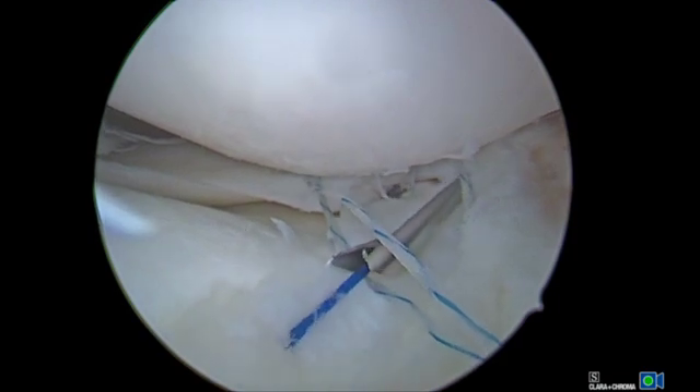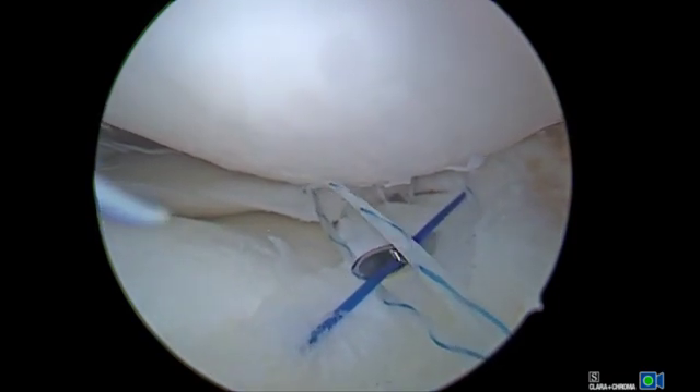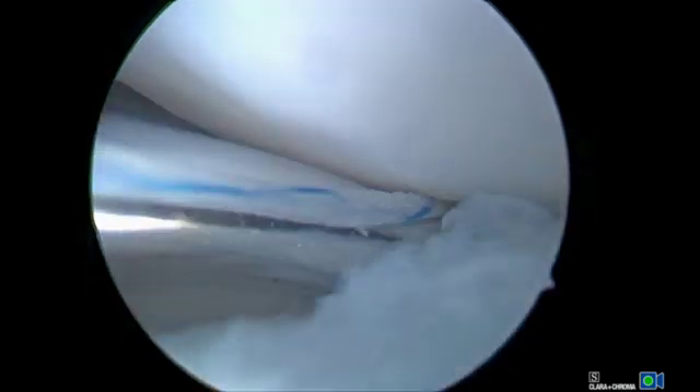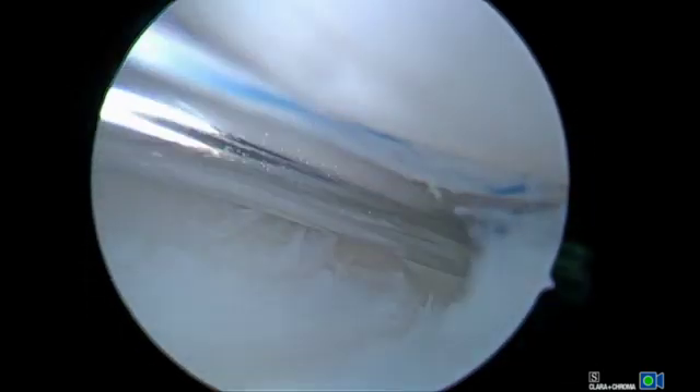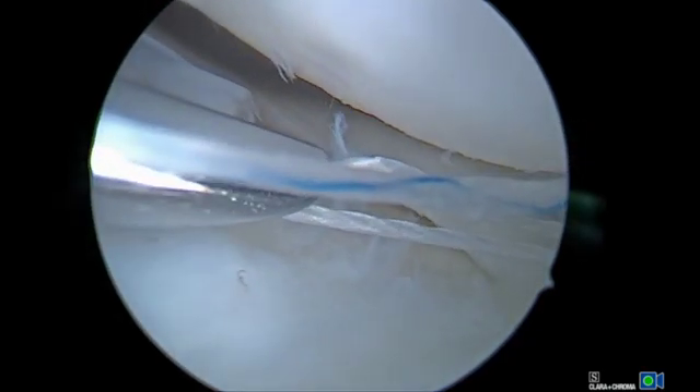Utilizing an outside-in technique and lateral incision through the IT band, one vertical mattress suture is placed in the anterior limb using the meniscus mender from Smith & Nephew, while the traction suture continues to hold reduction. An additional vertical mattress suture is placed in the anterior limb, as well as two vertical mattress sutures in the posterior limb, using outside-in technique with zone-specific aimers from Smith & Nephew.